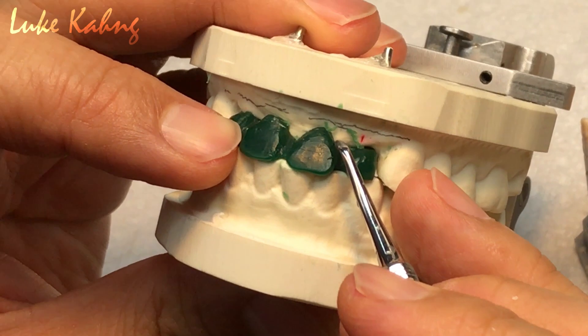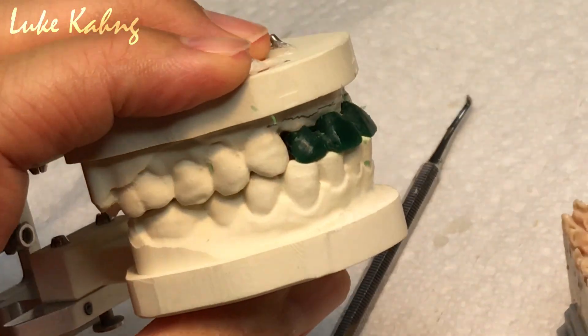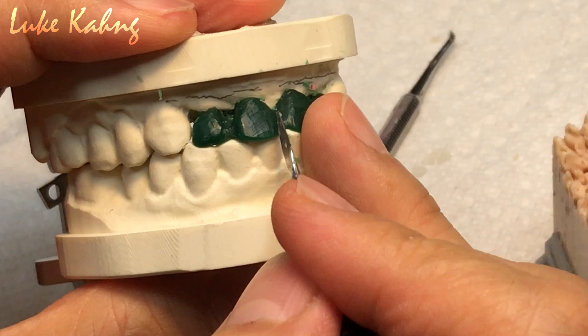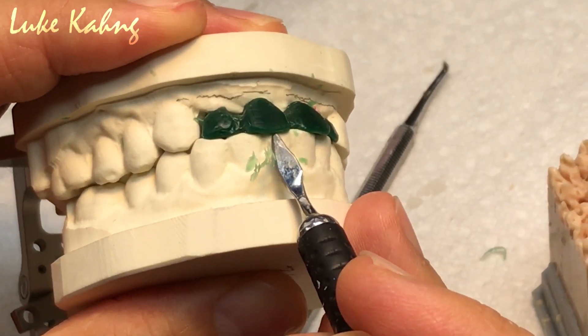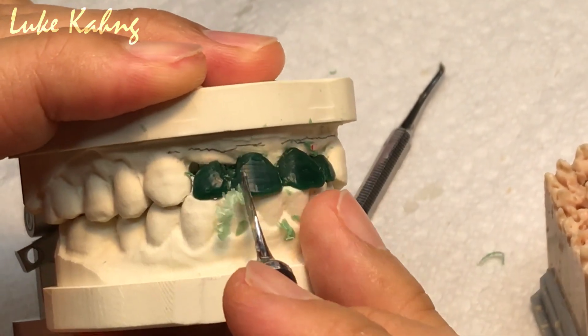And then second, I noticed this is too fat. So where did you grinding? Here side. Like I said here, like I did. This much you grinding. I'm not talking about here — I'm talking about this.